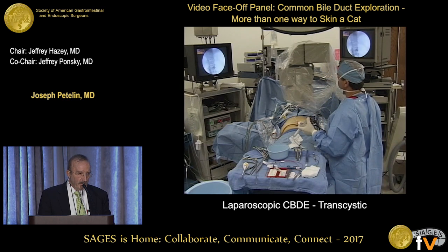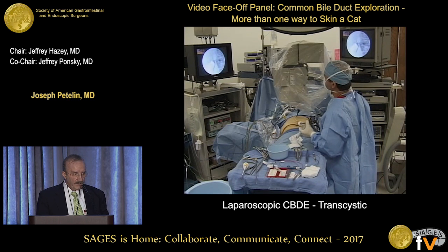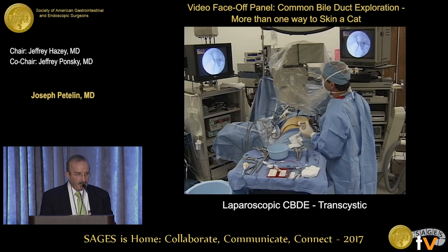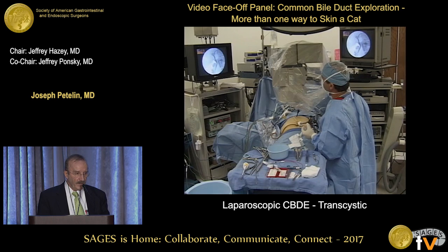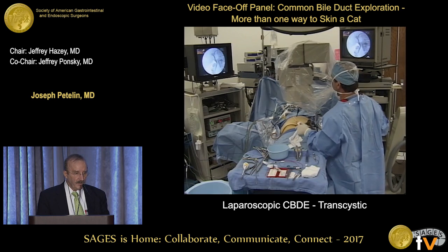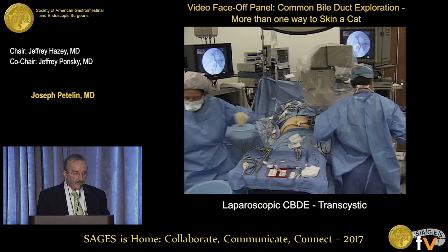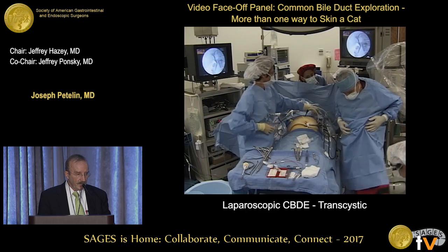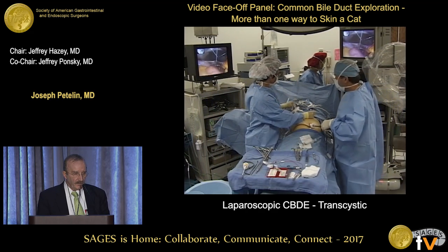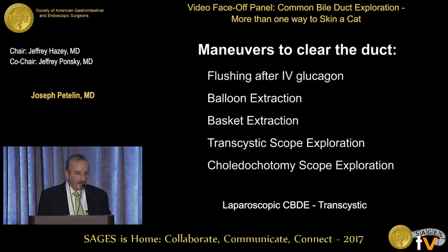So with the fluoroscope, we're able to scan the entire duct. In the old days that Dr. Ponsky and I lived through, we did static films that took 20 or 30 minutes to get back from radiology. This lets you do everything in about a minute or so. And then the surgeon can peel off the lead and proceed with the rest of the operation. Now coming up, there'll be about a 10-second black part of the video that didn't come across.